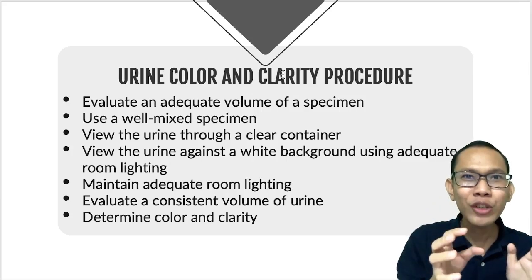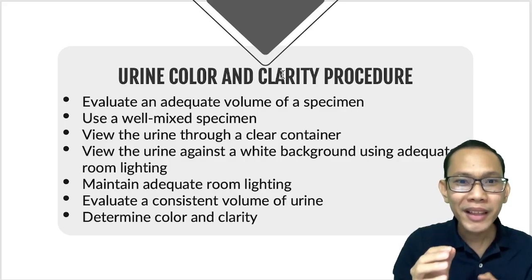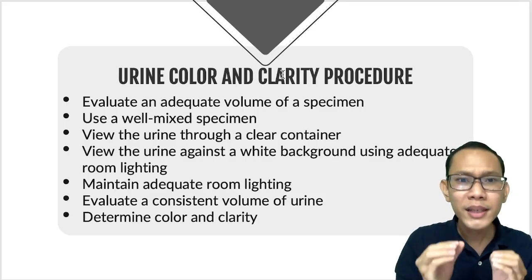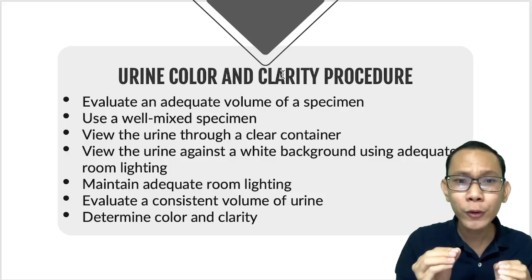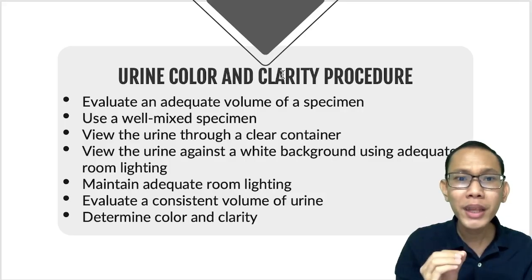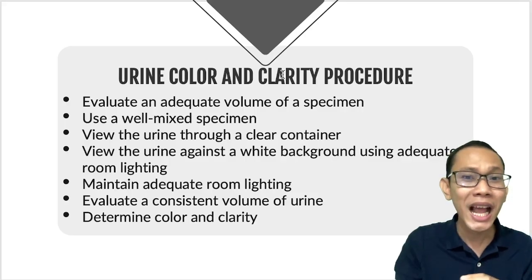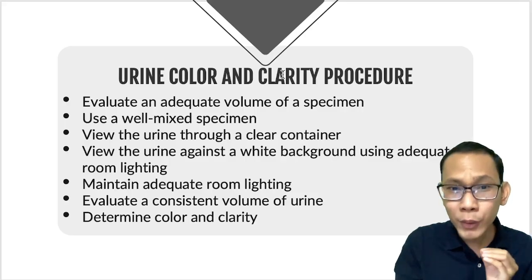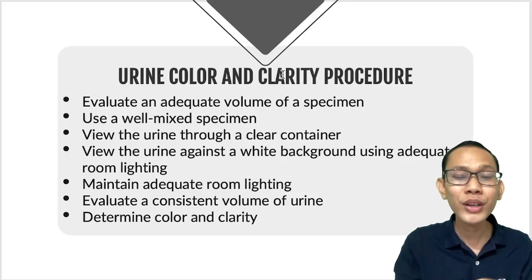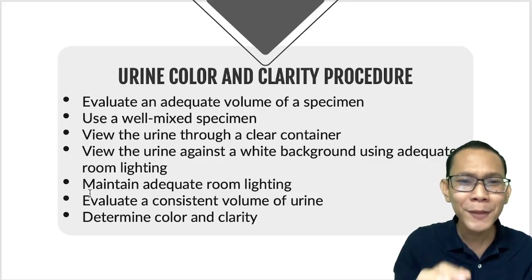When your physical examination says that it is turbid, then as a doctor, we would be expecting that there will be a lot of sediments or crystals or cells that can be identified in your microscopic examination. That is why, physical examination pa lang, dapat correct na ang ating reporting, because this will give us a clue later on sa ating chemical examination and in your microscopic examination. Dapat congruent yun siya, okay?